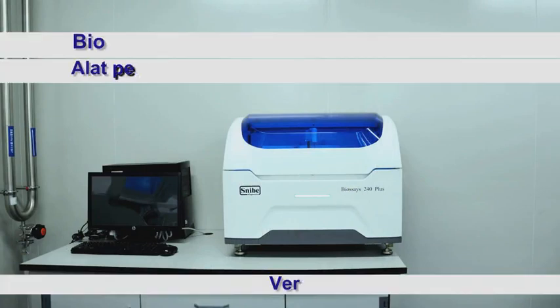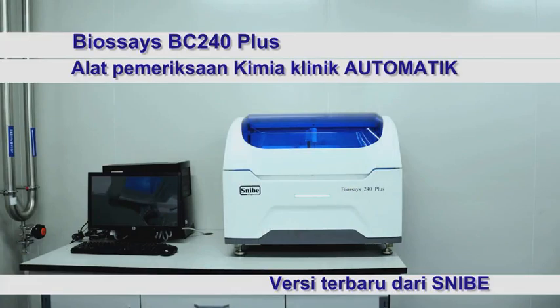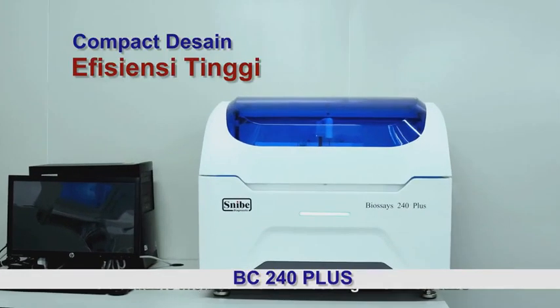Biossays 240 Plus, the latest Snibe biochemistry analyzer with compact design and high efficiency, is a reliable member worth choosing in clinical labs.